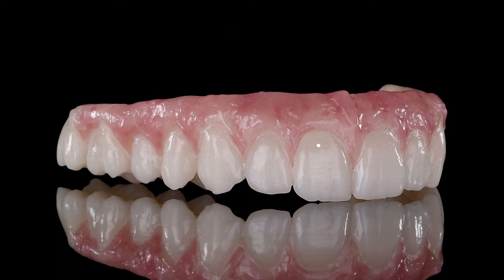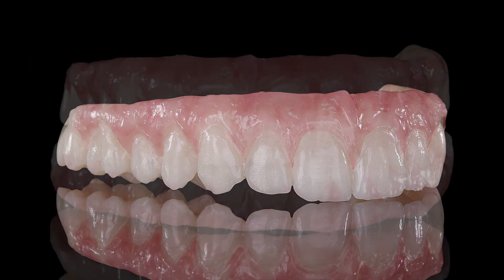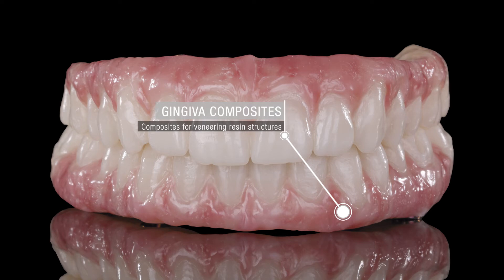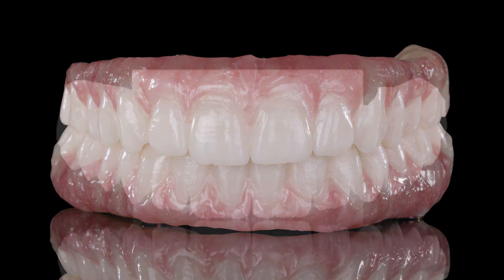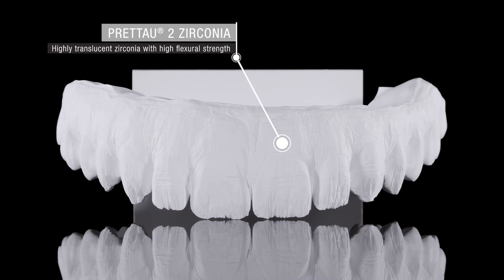The two multistratum flexible resin temporaries, designed on the virtual tooth library Heroes Collection, were milled and then veneered with gingiva composites. These temporaries served as a reference for the final restoration.